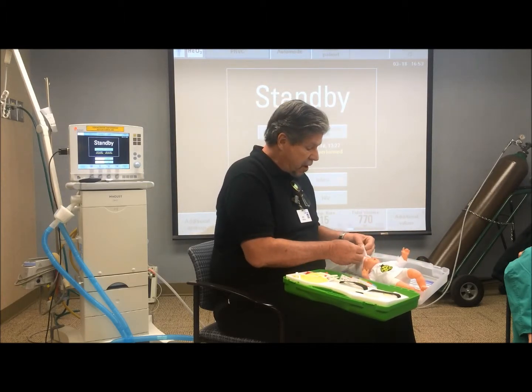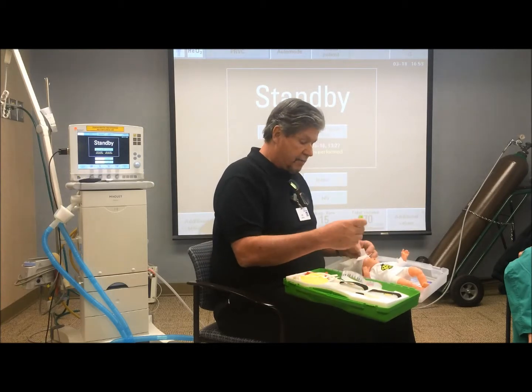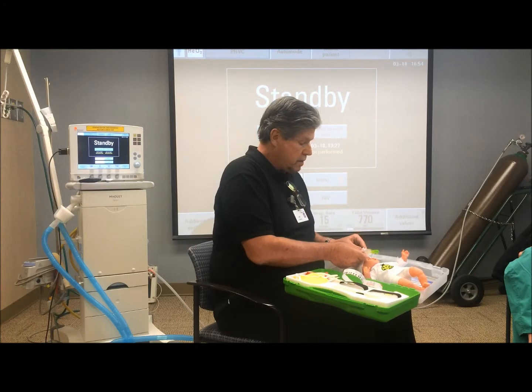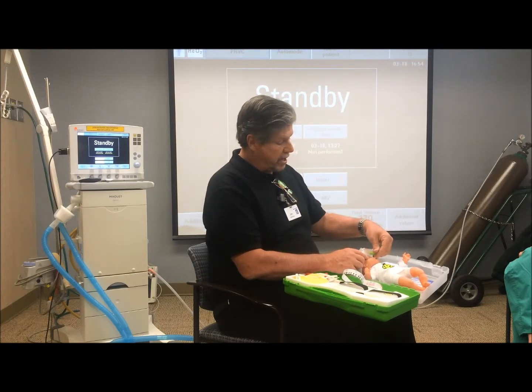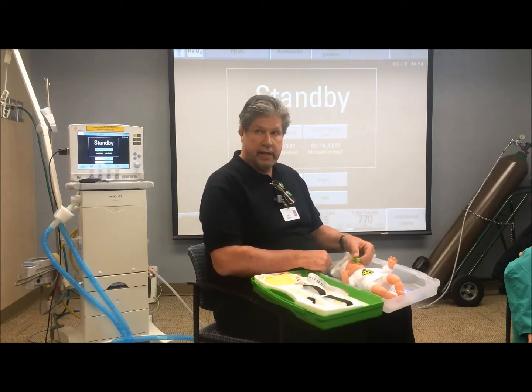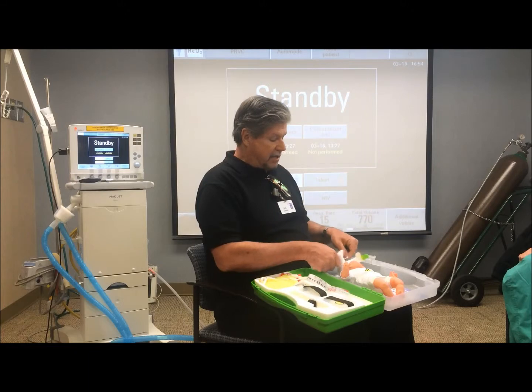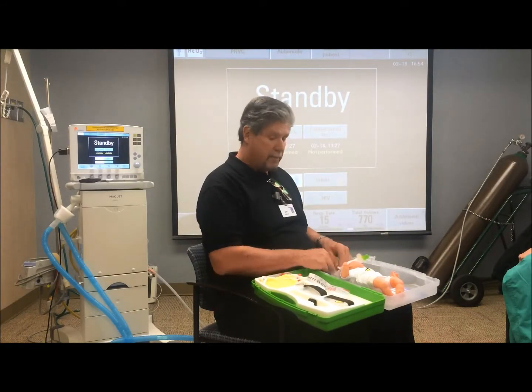Now this part comes apart, it's got this little divider in it, and so what you'll end up doing eventually is doing this, and positioning it appropriately before you tighten it down, so that the mini flow is ready to be in the right position for the nares. You all see that? And then the top of the hat has little ties on it, so you can tie a bow and keep the heat in on the top of the head. That's what these are for.